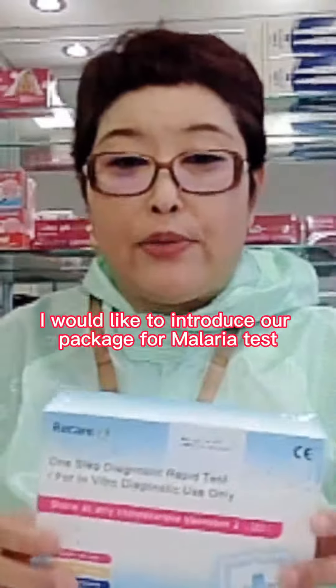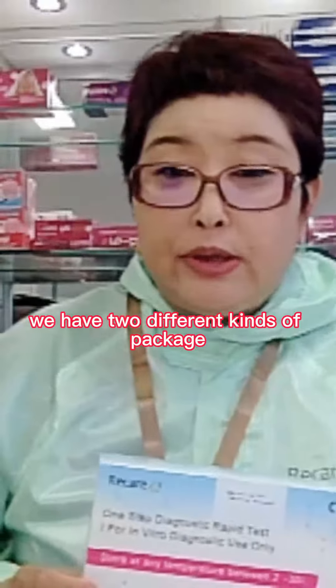I would like to introduce our package for MalariCast. We have two different kinds of packages.